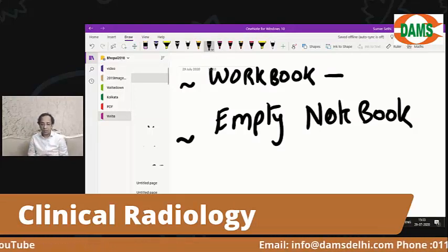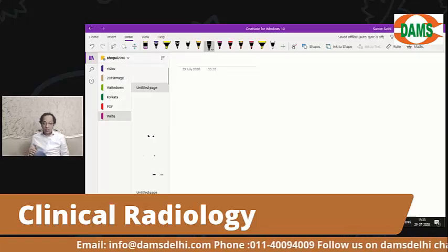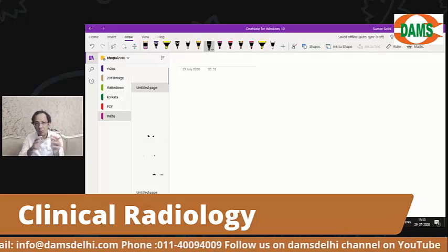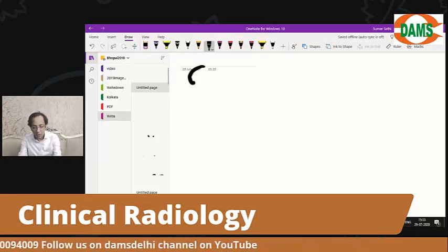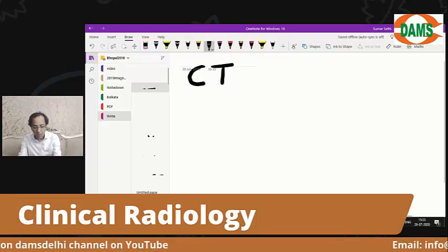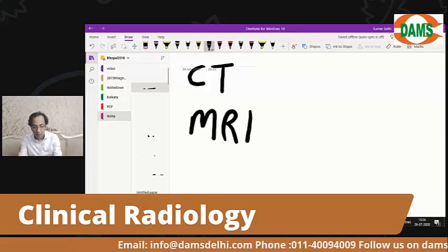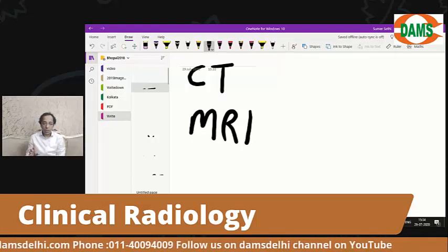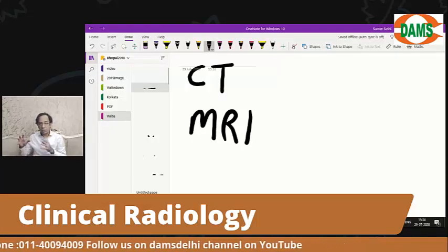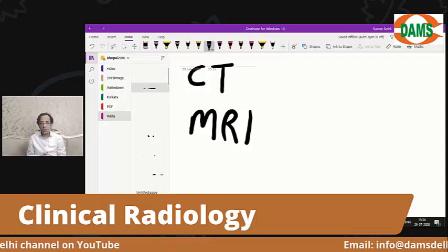Now, to begin with, I'll tell you how the classes will be distributed and what will be the flow of my topics. Today I will start with the topic called CT scan. Then I will go on to a topic called MRI. My goal for today is to finish the concept of CT scan with you, and then teach you how to look at CT of the brain.